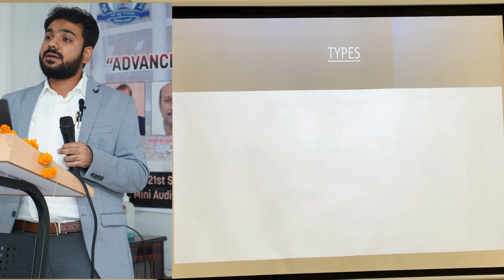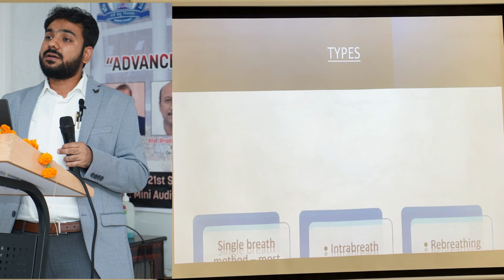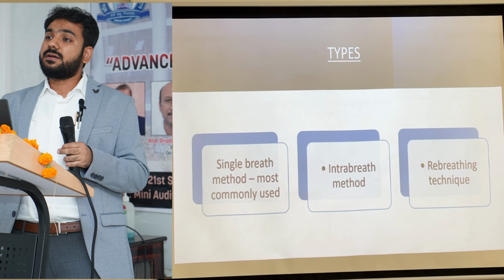Whenever we talk about DLCO, the most commonly available test is the single breath holding method, in which we do a breath hold maneuver for 10 seconds. That is the most commonly available type of DLCO. It's easy to perform, most standardized, and relatively cheaper. But there are other types through which we can do a DLCO test. Just for the sake of information, there is the intra breath and rebreathing technique.